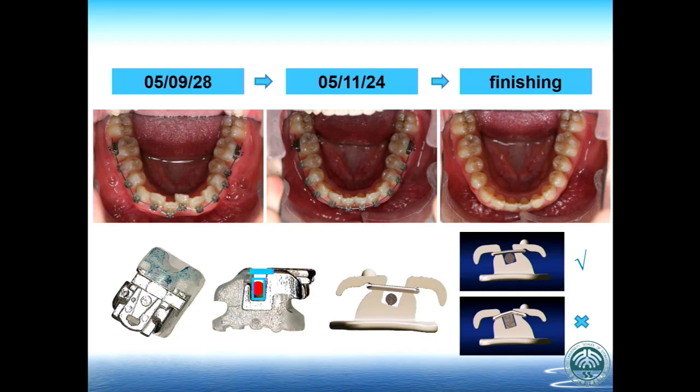Yes, a larger round archwire is better because these brackets still need a ligature. It's not a real self-ligating bracket. This is enough. We don't need more force or more pressure. But what else can we do to reduce the first order friction to make the tooth movement efficient?